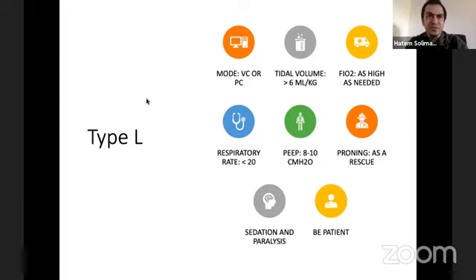Or on the other hand, with CT, you often see the ground glass appearance with no consolidation. But we found with experience that these patients do well with proning, and this probably could be explained by the redistribution of lung perfusion with proning, and also some suggestion that these patients have microatelectasis, which could be relieved or improved by proning them. So we do a series of proning for these patients, and some centers even do extended series of proning, up to 5 or 7 proning sessions.